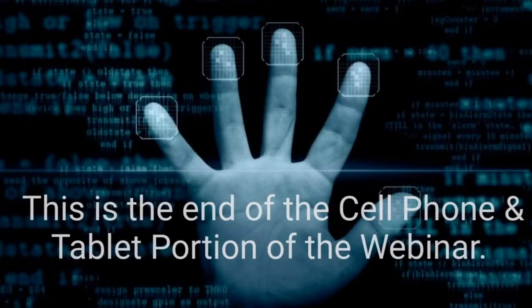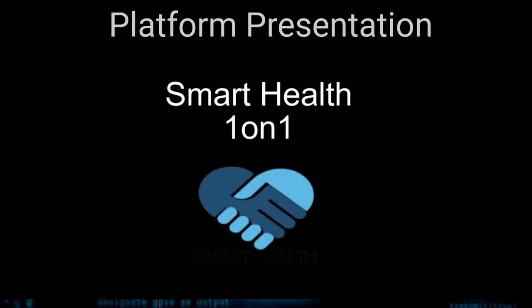Welcome to Smarthealth1on1 pre-recorded webinar. Part 2 will focus on the platform.